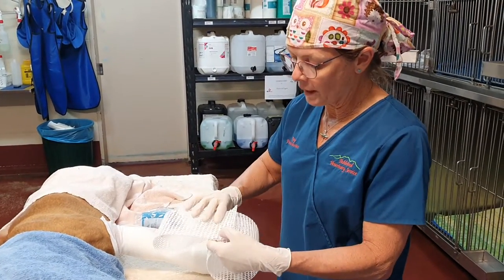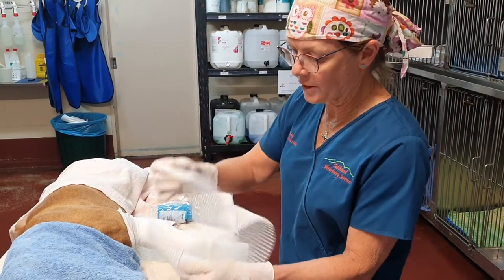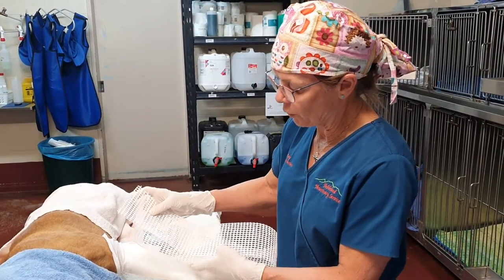We would want four layers if doing a lateral splint. I'm not going to get four layers out of this leftover, so for the demonstration it will only be a couple of layers — maybe three. We go for four layers.